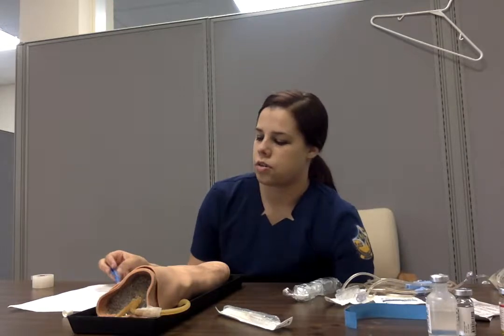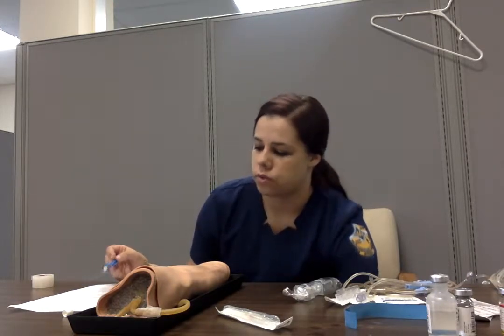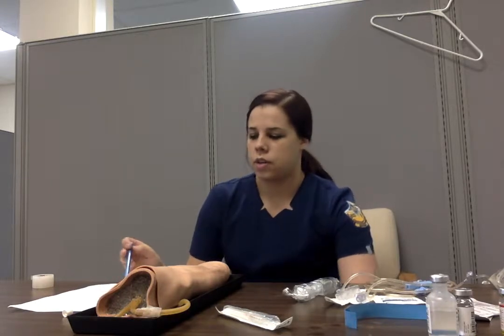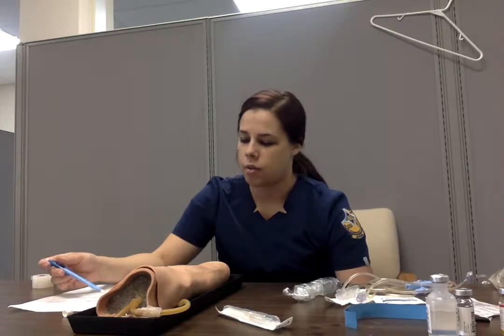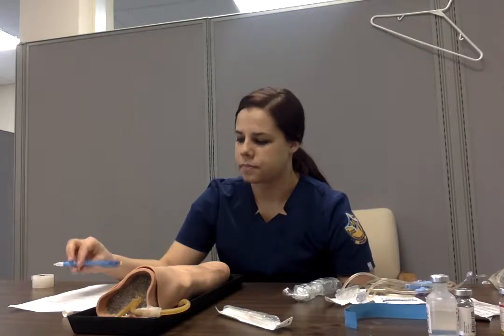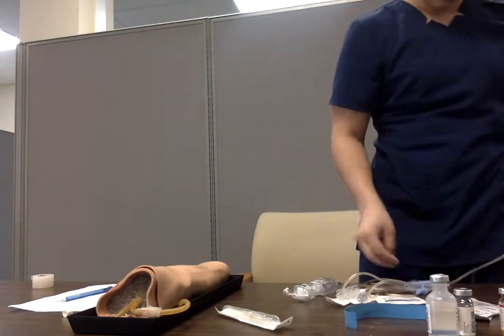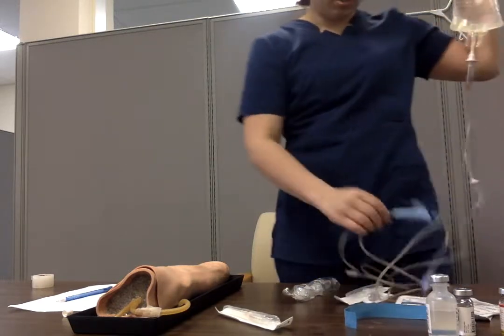And I would tell him that he has an IV ordered for 0.9 NS 1,000 mLs to infuse over 6 hours. So the ml per hour, I would put an absorbent pad on, and then the ml per hour would be 166.7, which is about 28 drips per minute and 7 for 15 seconds. So I'm going to hang my IV tubing.